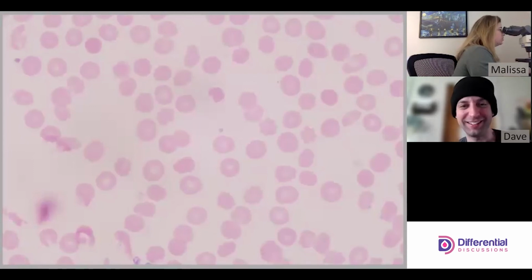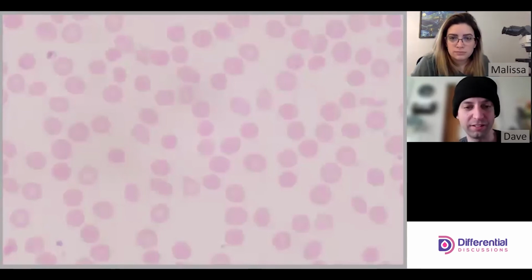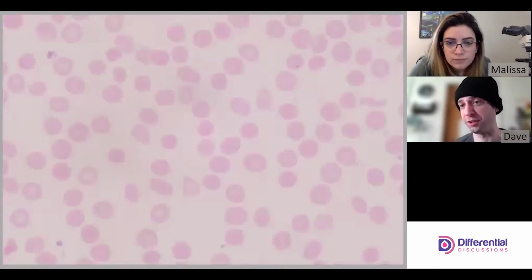Let's just move on a little bit more. So we've gone through several fields now. I'd say that the echinocytes have held, right? So we can say with pretty high confidence that this isn't an artifact on the slide. It could still be a draw issue, right?